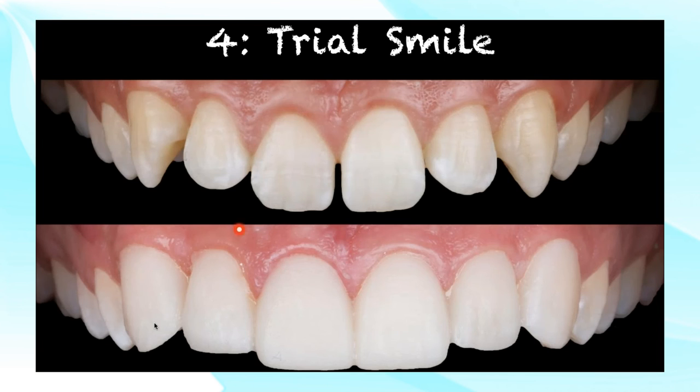And the great thing about this is that it's not bonded. So the patient can actually go home with this. And it usually falls off within a day or two, or if they eat something crunchier, they just take them off themselves. But again, it's only a trial. So the patient goes home, they show this to their loved ones, they show this to their spouse. And the importance about this trial smile is that we're creating an emotional investment with the patient.